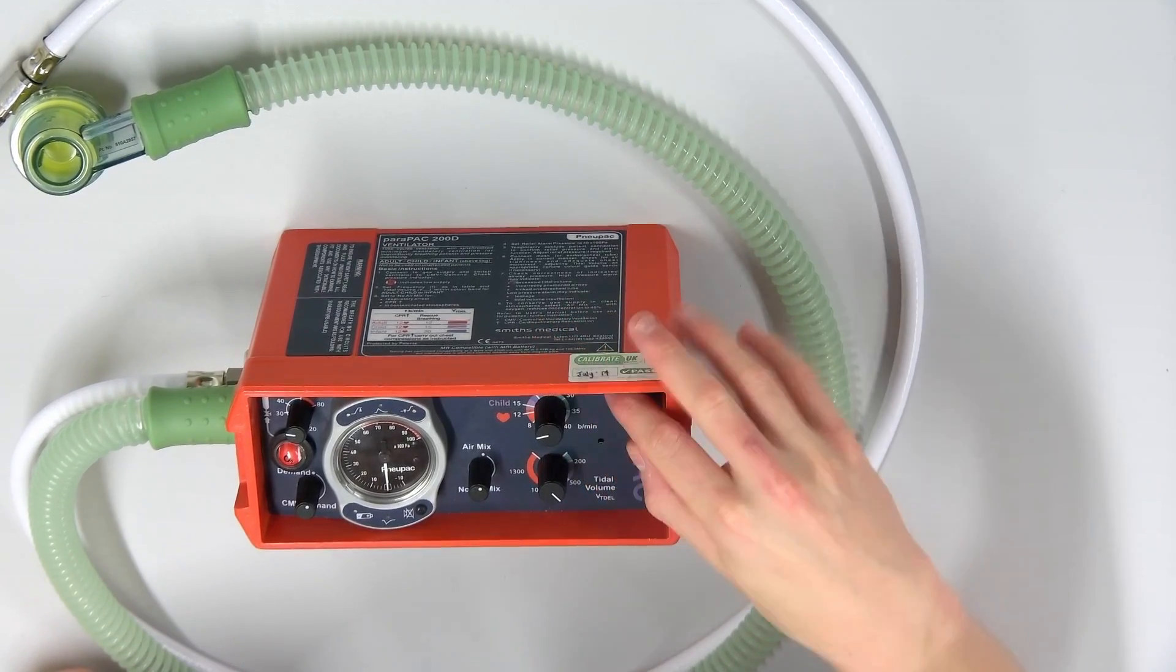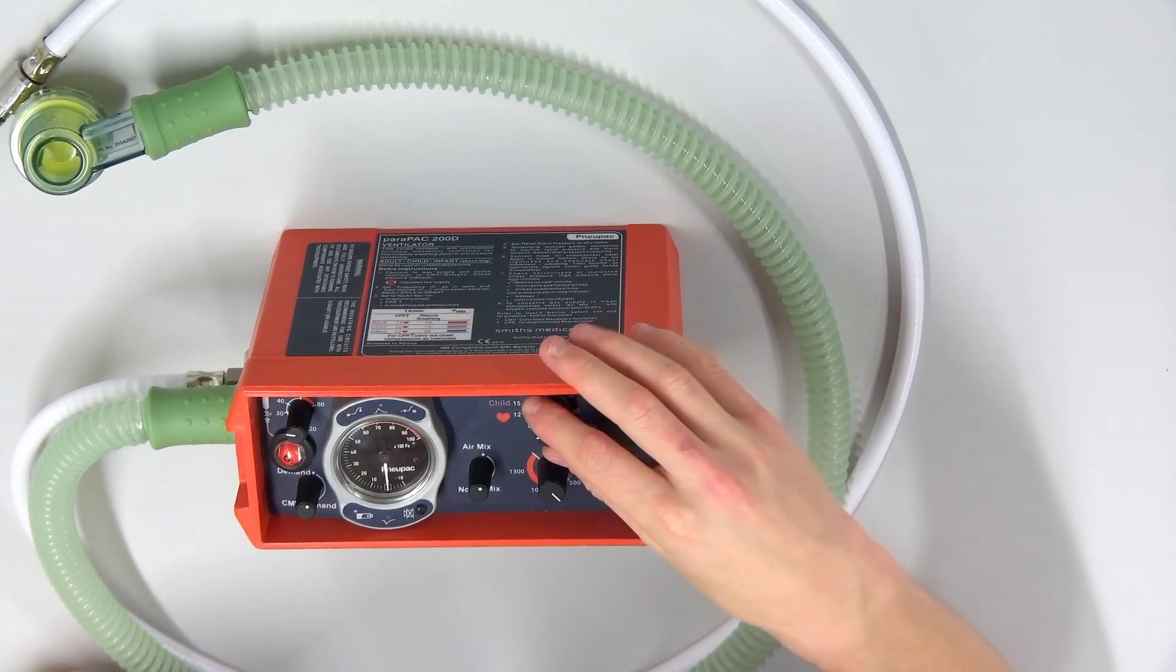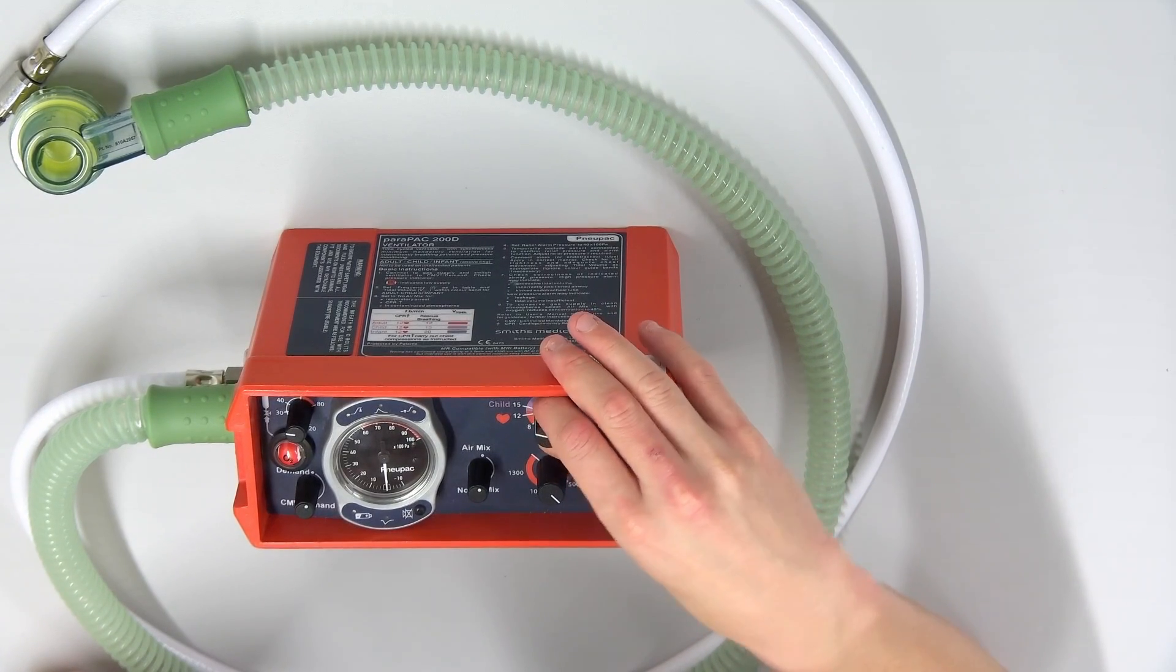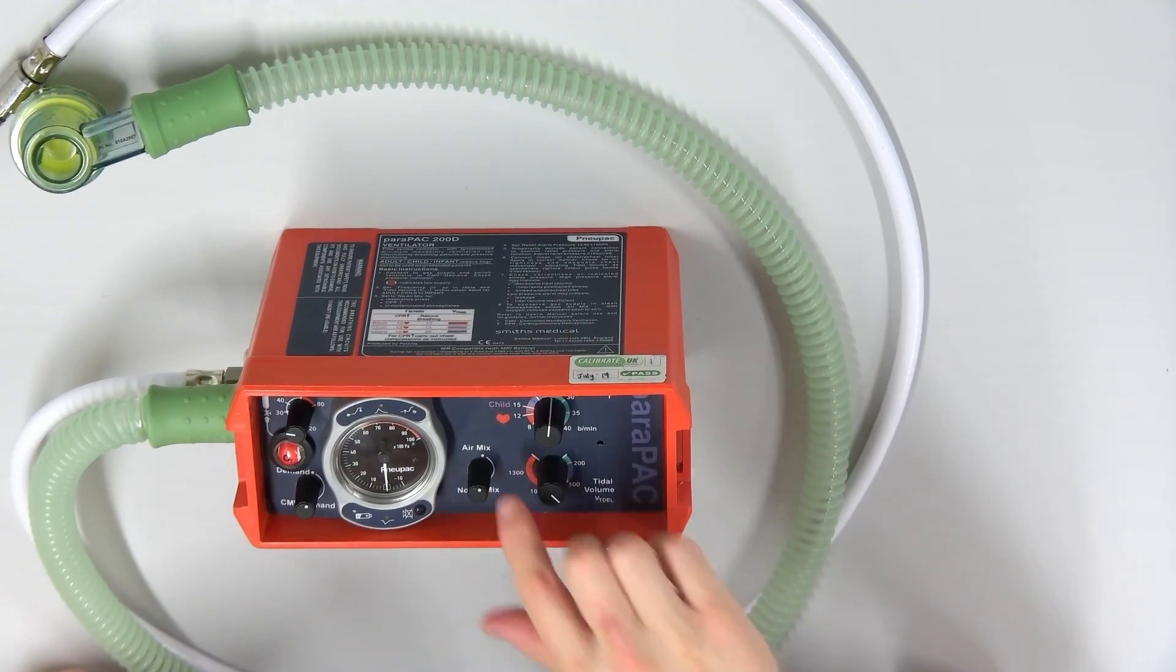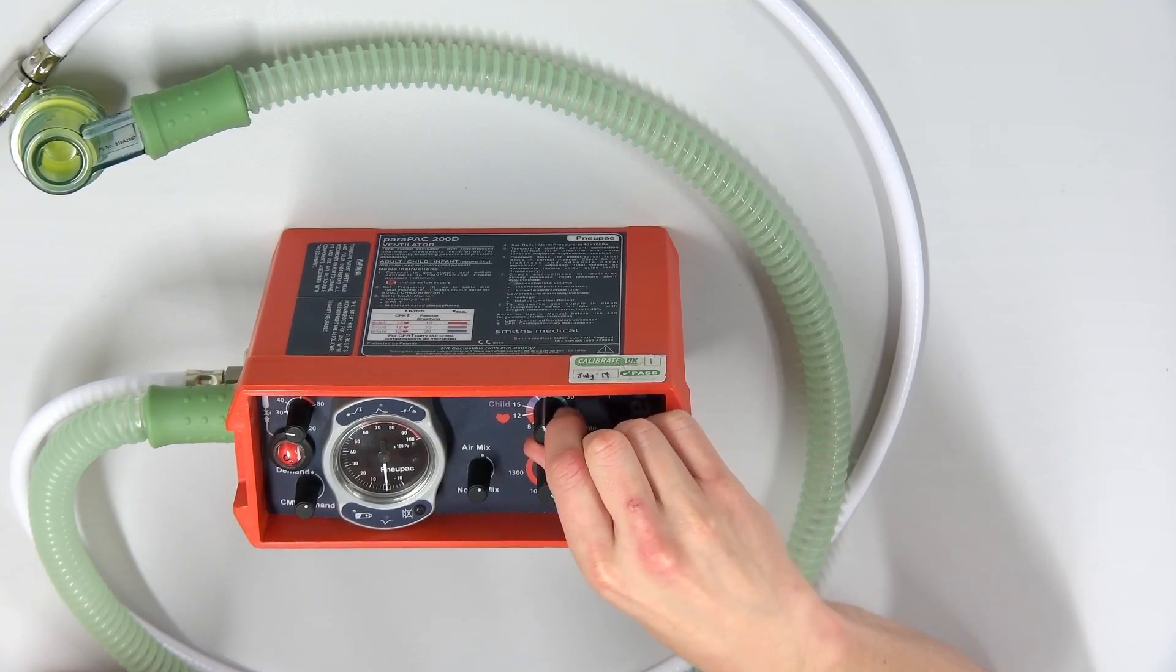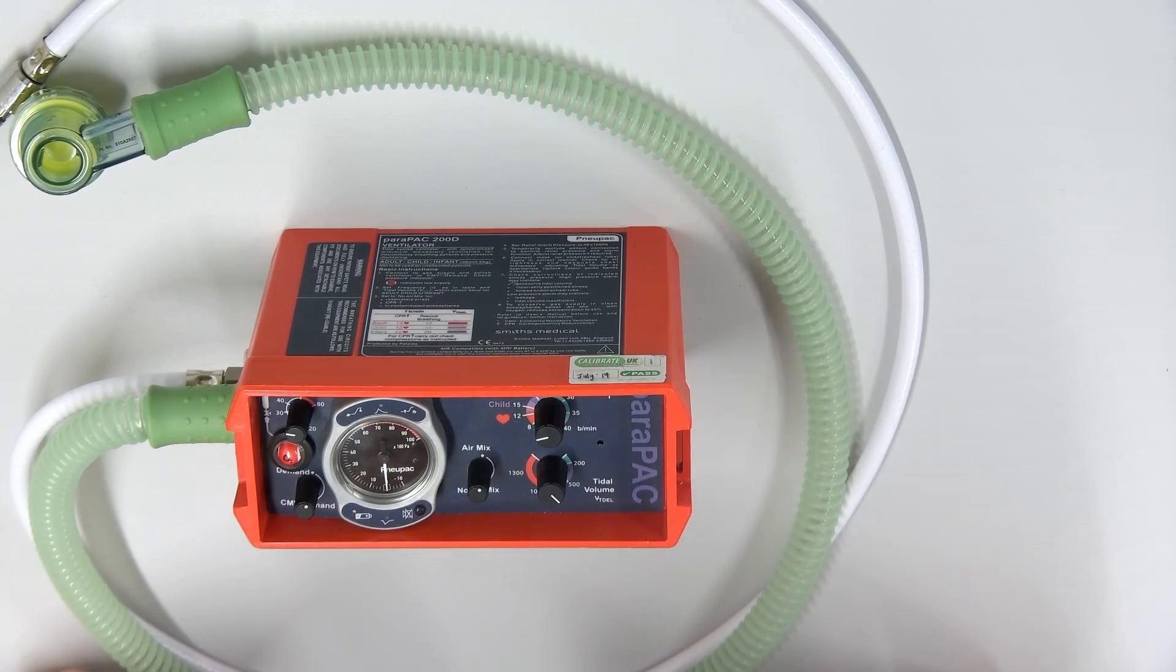Up here we have our frequency or our respiration rate or breath rate per minute. An adult would be in the red, a child would be in the purple, and the infant would be in the blue. So children breathe faster, adults breathe slower. The heart symbol here is actually a CPR rate, so that'll give a ventilation rate at one breath every five to six seconds.